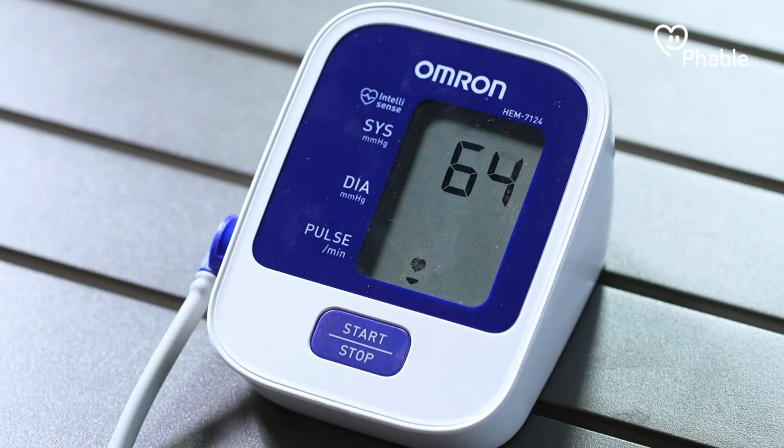Do you feel any pain because of the cuff pressure? Don't worry. This usually goes away in 30 seconds. But if the pain is unbearable, you should reach out to a doctor. It will take 30 seconds for the monitor to display your readings.